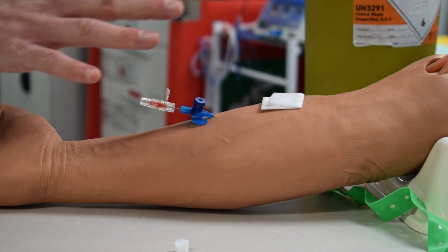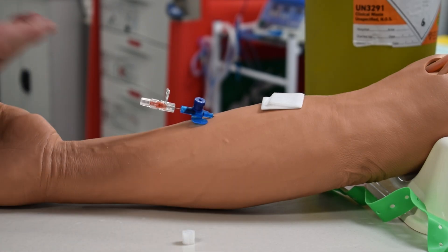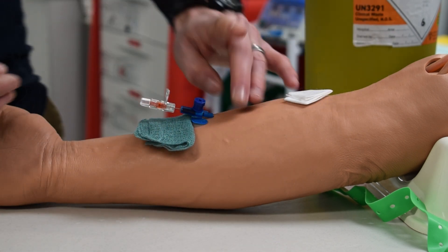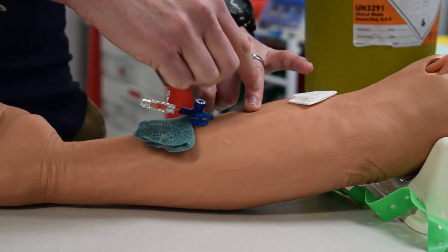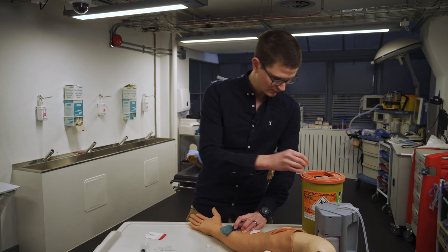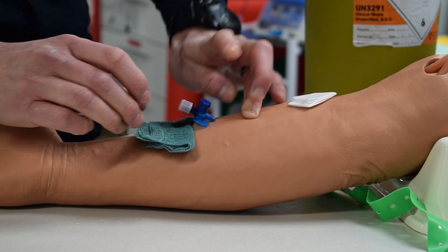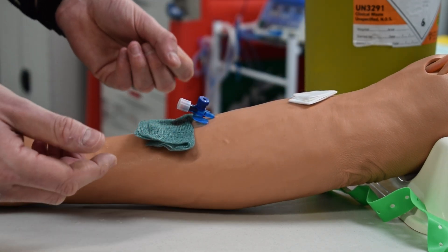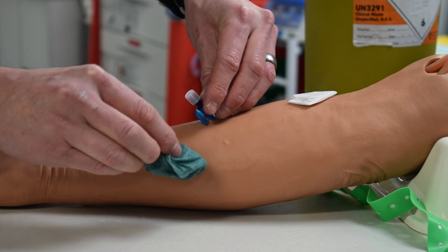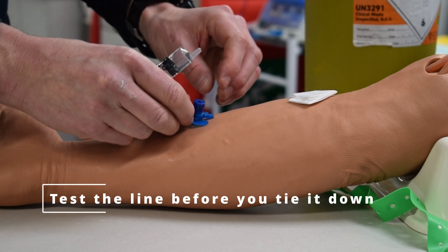It shouldn't be bleeding much — we now have control of the situation. A little trick I've learned is to put something absorbent underneath to catch whatever blood we're going to get, because it probably is going to bleed. We put a finger at the end of where the cannula is, pull the needle out, sharps away, close it up. There was some bleeding but this caught all of it, so we don't have a mess under the patient.